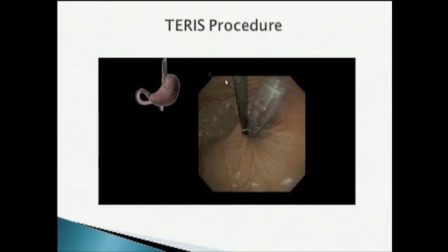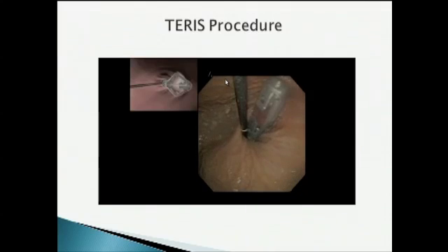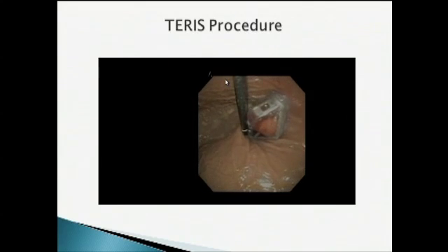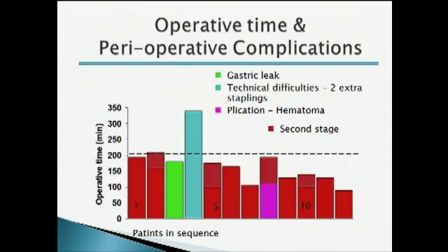And this is where the endoscope is basically introduced into the stomach, retroflexed, and the distal element of the device is used to create a plication through which the anchor will later be inserted. There's an animation on the side. So you create the suction effect to make sure you have a full thickness piece of the stomach through which you're going to place this anchor. The issue, of course, with partial thickness is the concern about detachment. Okay, now I'm going to skip through the video.